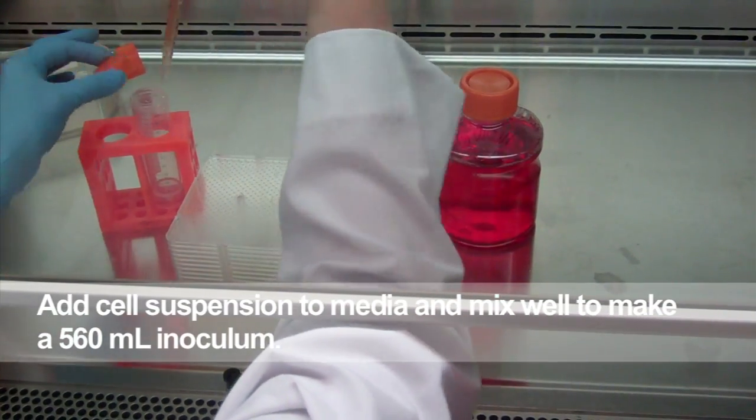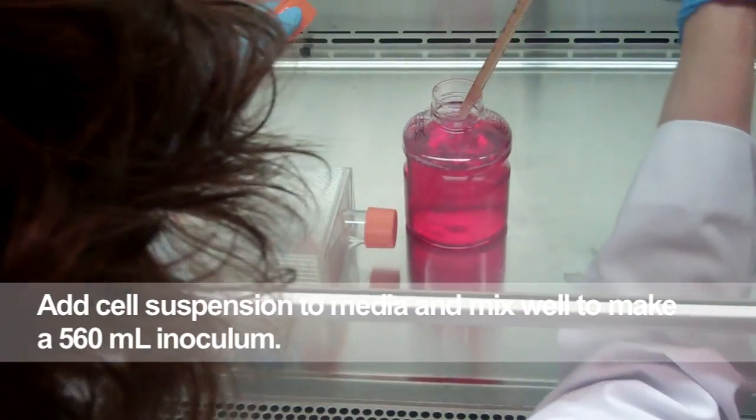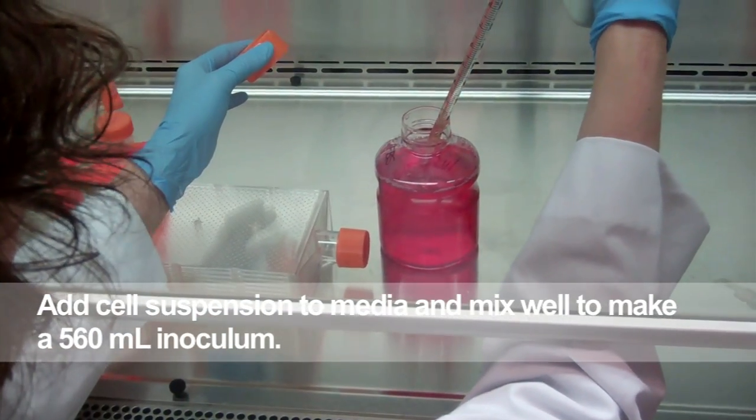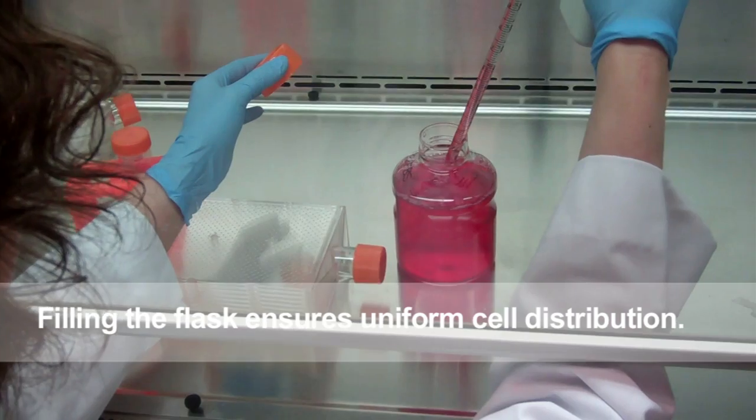To seed a hyperflask cell culture vessel, create a 560 mL inoculum of cells. By using enough media to fill the entire vessel, you'll guarantee a uniform cell distribution.